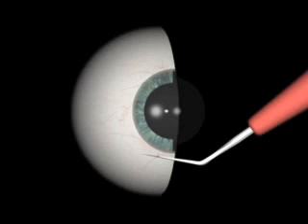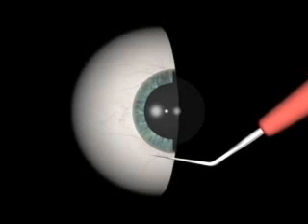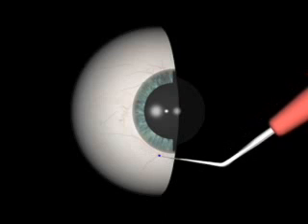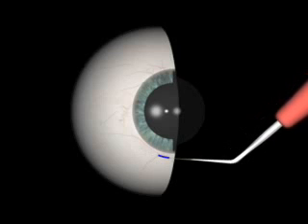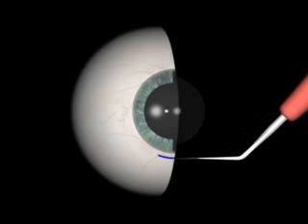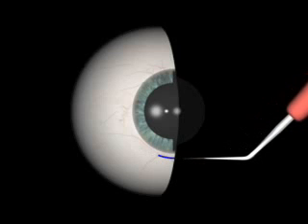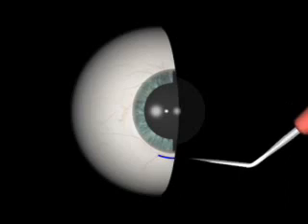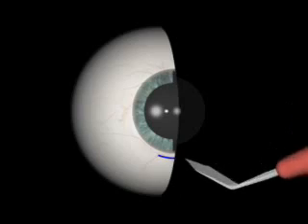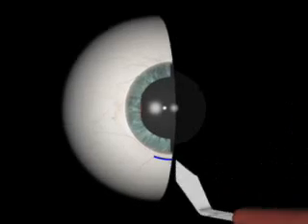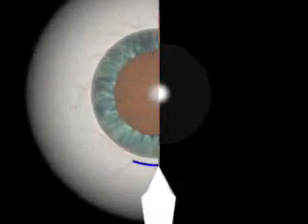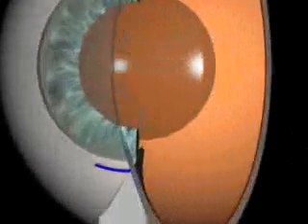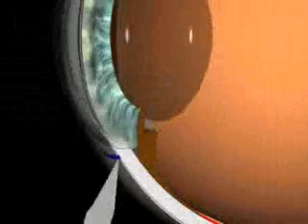Small incision surgery begins with a self-sealing incision, in this case a limbal corneal incision using a crescent knife. A 3.2 millimeter width perpendicular pre-cut is made at the limbus, followed by preparation of a corneal tunnel and then entering the anterior chamber.